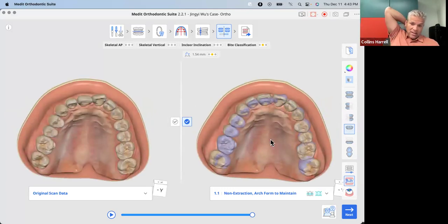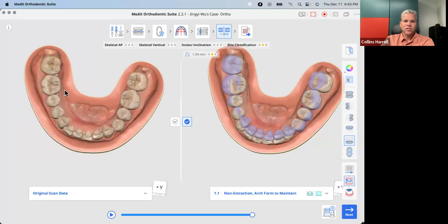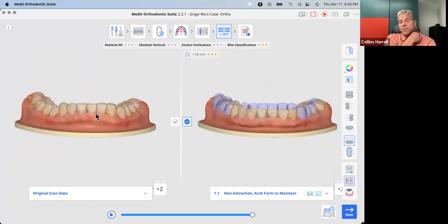The only reason why I like aligners is, one, she doesn't really have that much crowding or rotations. And so it does seem like a case that she could go to aligners at some point. When you do go to aligners with those strong muscles, you'll definitely want to use lingual bite ramps so that she doesn't bite on the aligner in the back and intrude those back teeth.